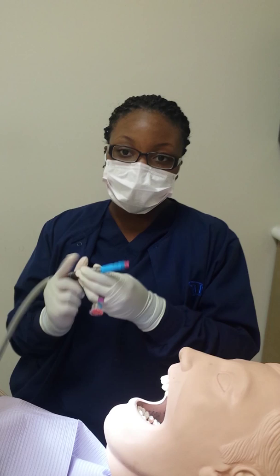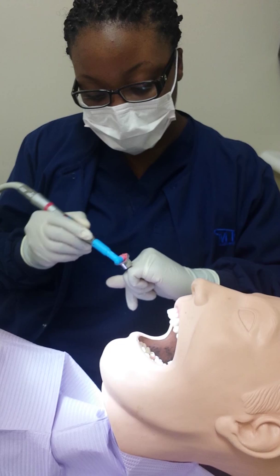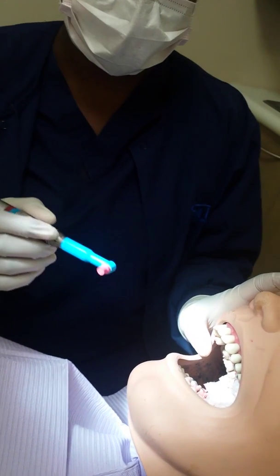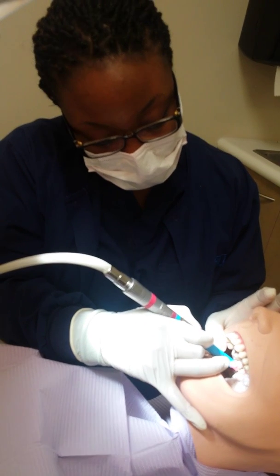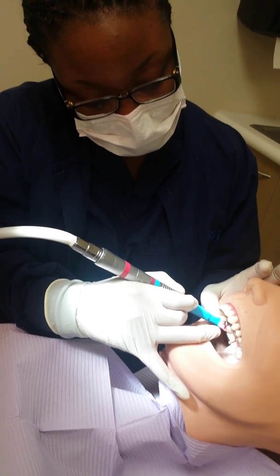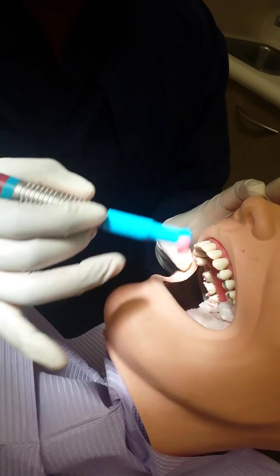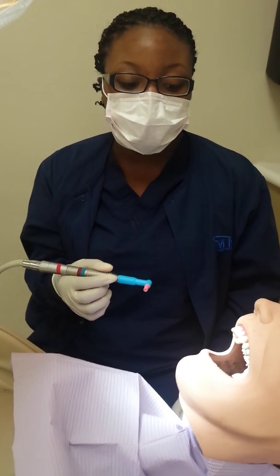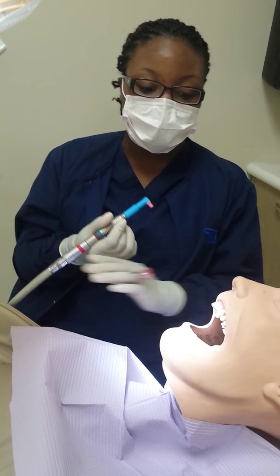Then you would need your prophy angle and this is your prophy paste, and you're going to start from 1 to 16, which is the maxillary right side. Because I'm right-handed, I'm going to start here — just like painting nails — and don't forget your fulcrum. You would do that all the way over to 16, then come back over to the maxillary left side and work your way down, doing the same for both sides.